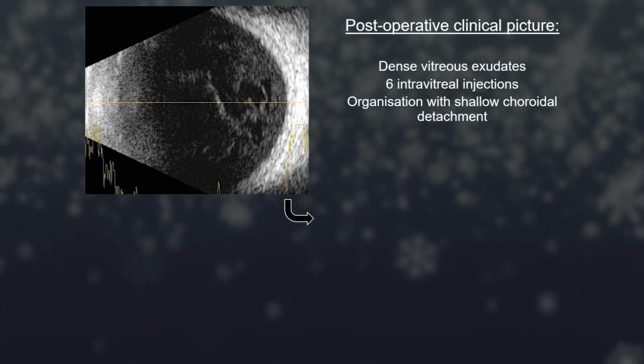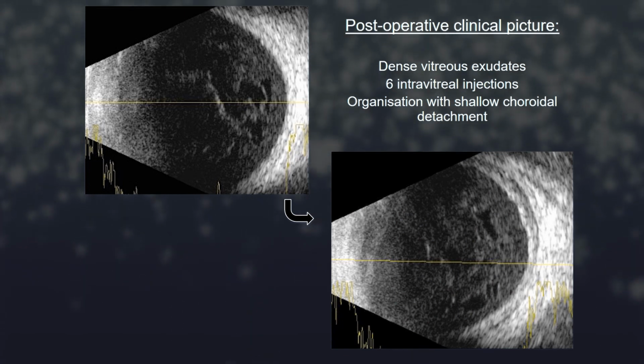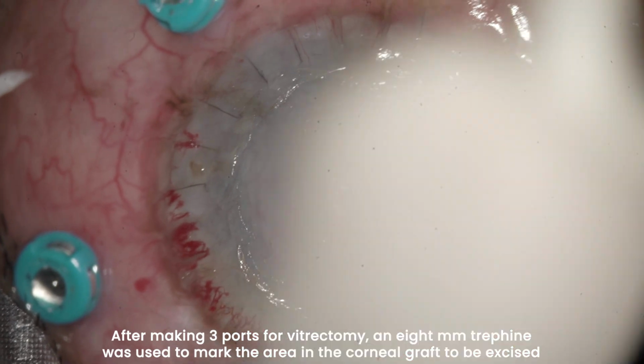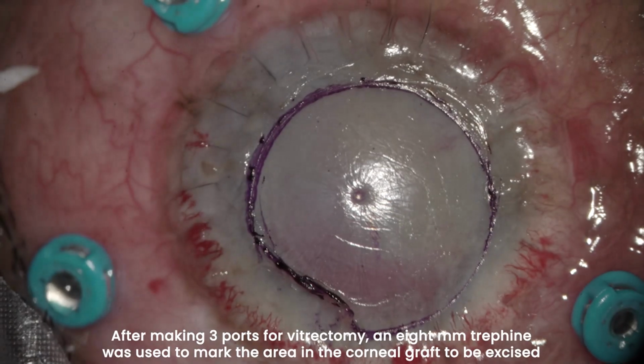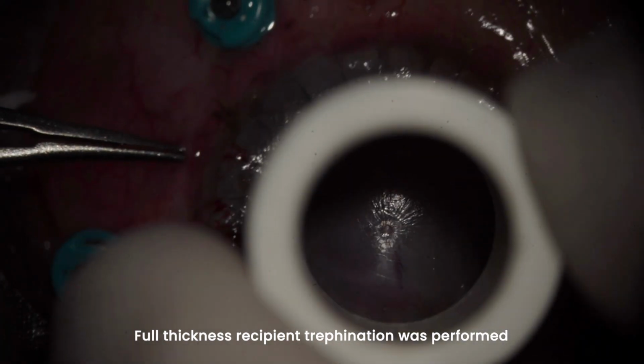There was a gradual organization of these vitreous exudates with a shallow choroidal detachment subsequently. The patient was then planned for a repeat penetrating keratoplasty with cataract extraction with a pars plana vitrectomy. After making 3 ports for vitrectomy, an 8 mm trephine was used to mark the area in the corneal graft to be excised. A full thickness recipient trephination was performed.